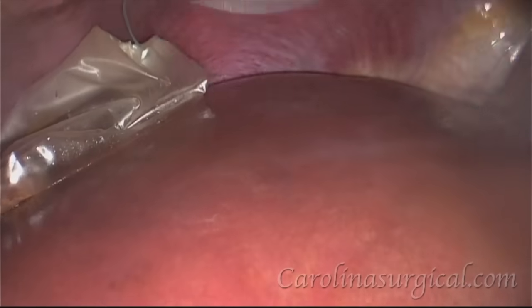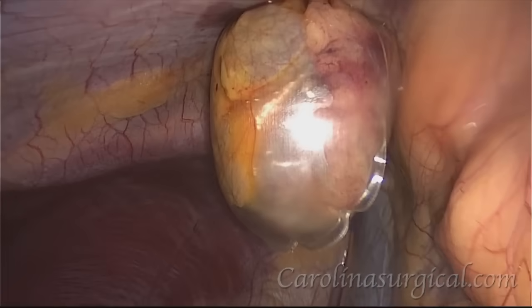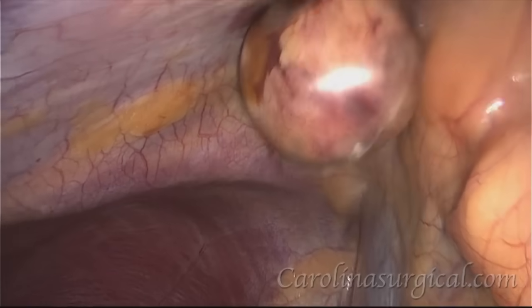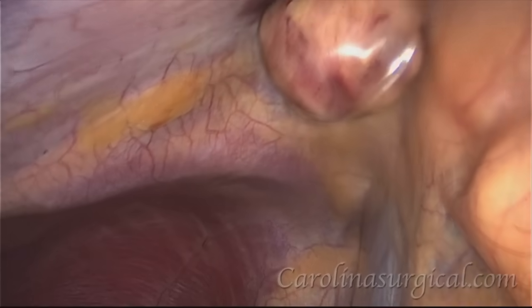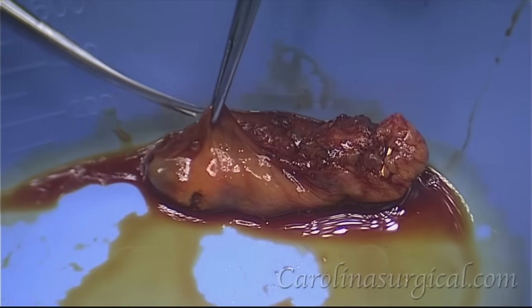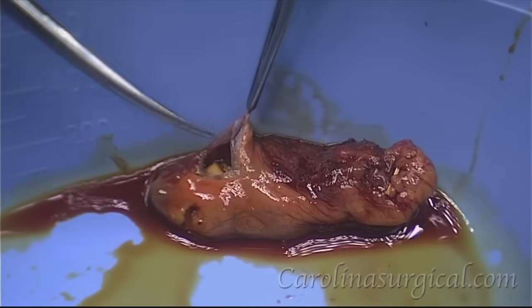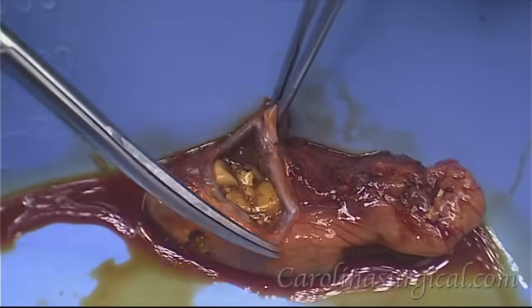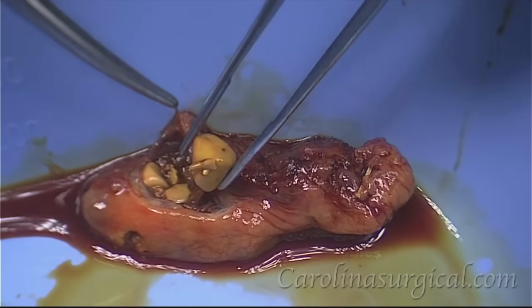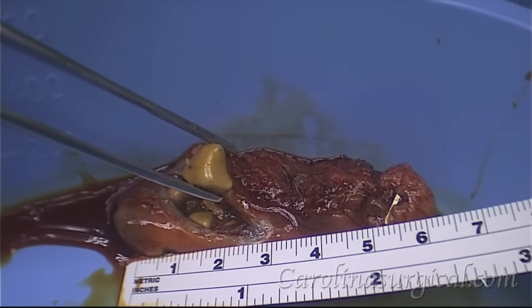We're just going to grab this string that's attached to our bag and pull the gallbladder out through this upper incision here. And there it is. We're just going to cut this gallbladder open so we can see what these stones look like inside of it. You can see some golden looking stones there, and that stone is about one centimeter, or just shy of half an inch.